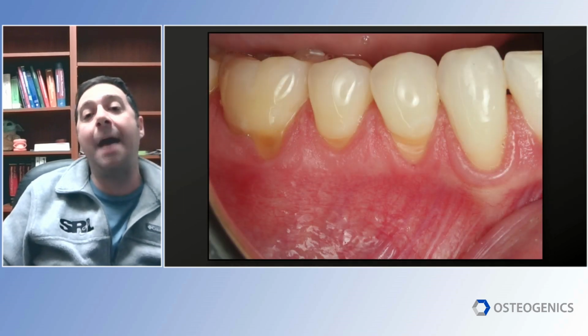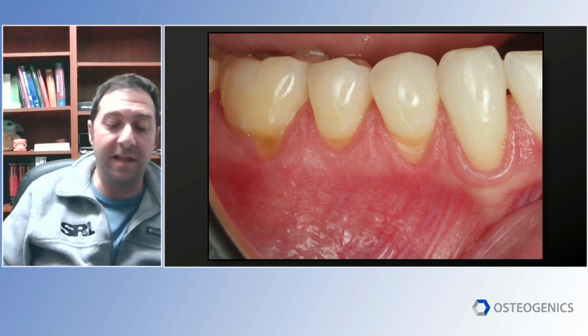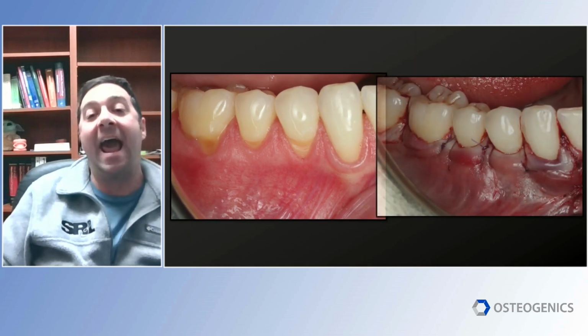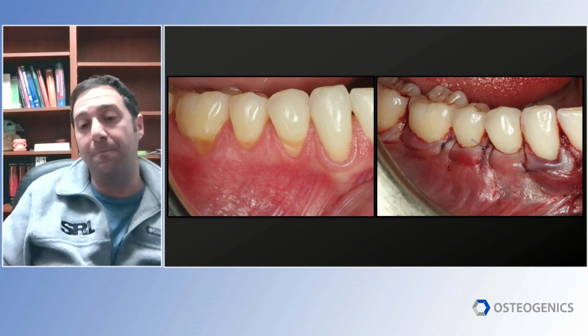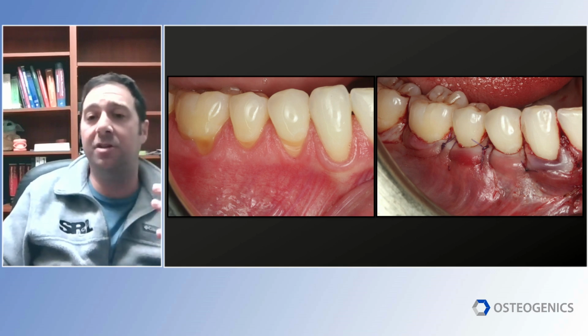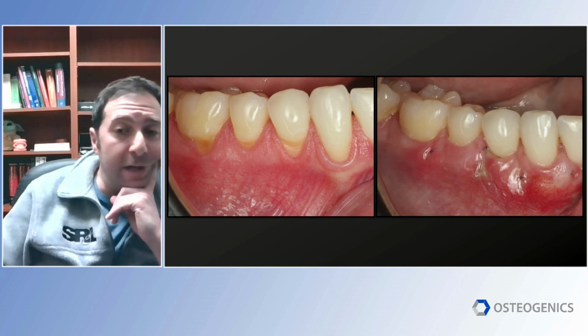So what happens when things get exposed? That's a question that's been asked of me too. Here's a case where I actually had an exposure of microderm. I did the case just like I normally do, a vestibular access incision and sling sutures. The patient came back at 2 weeks looking like this.